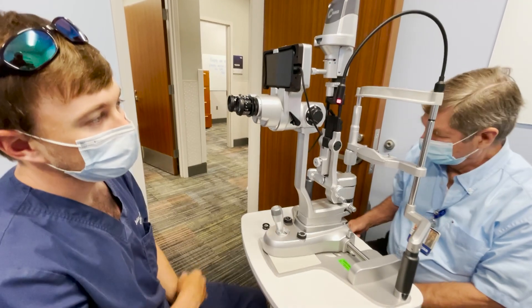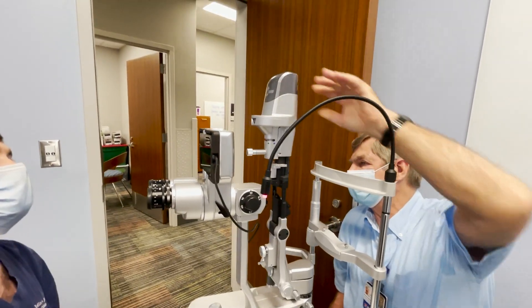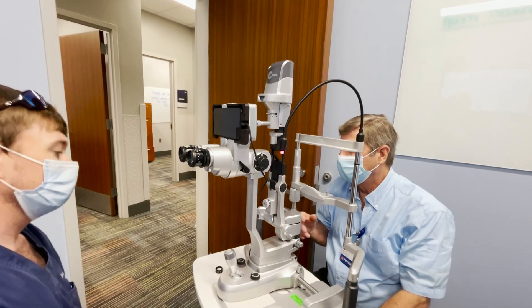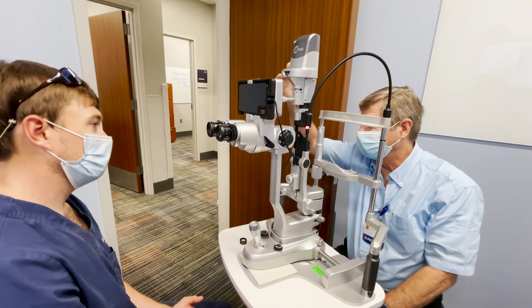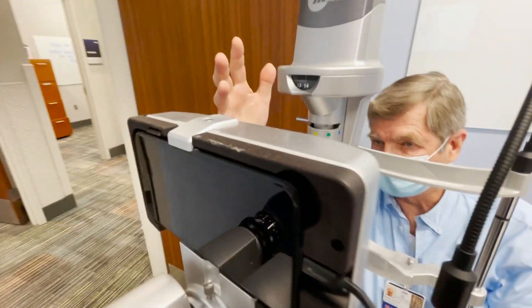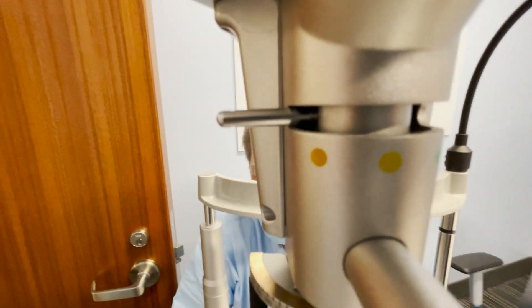There are a lot of other features, but basically the only ones we need are the intensity of the beam, the width and height of the beam, and the color. The only colors we're going to use are white and blue. Green can be used to look at the retina — for example, it can make a macular pucker look more detailed — but it's really not necessary.